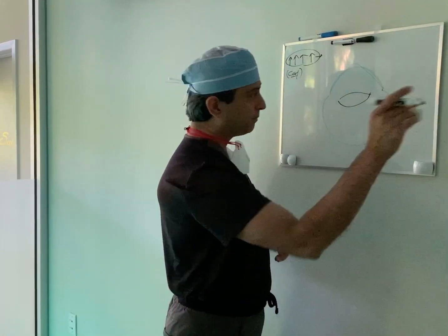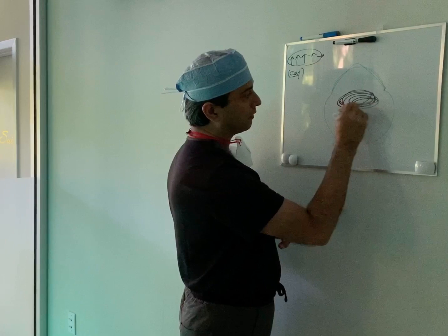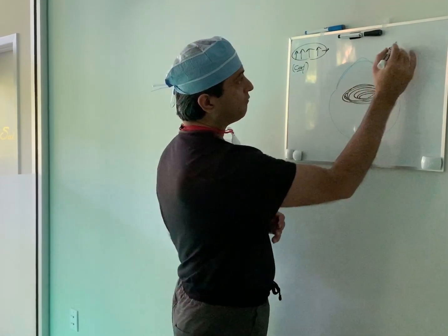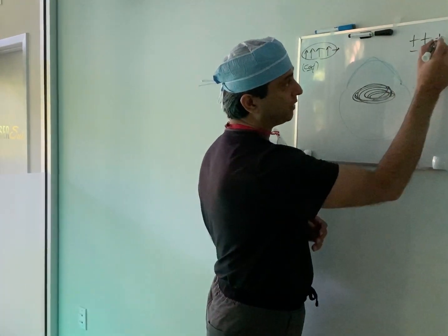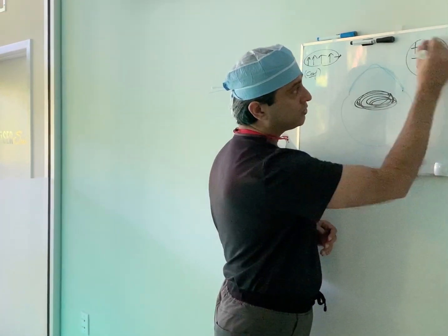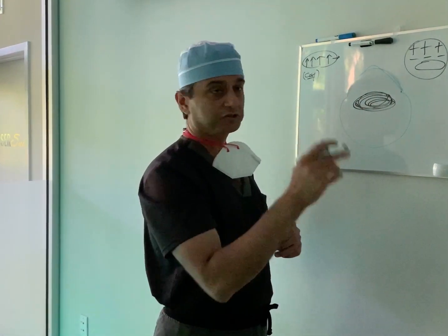So one of the patients we did today had early cataracts, keratoconus, about 60 plus years old, very high hyperopia, that's my first pin, very high astigmatism, second pin, and then of course presbyopic by this age, third pin, no scar and cataract. I went over here to get everything with the toric lens implant, sutureless, just finished the surgery, it takes a few minutes.